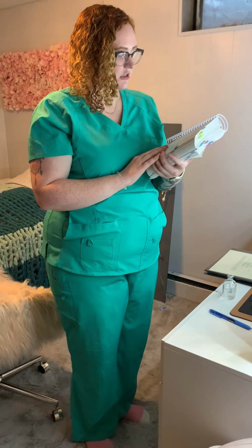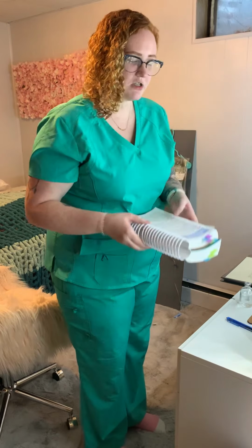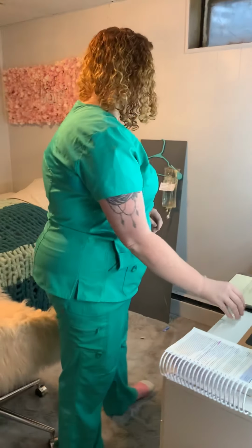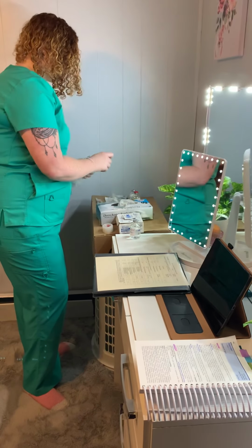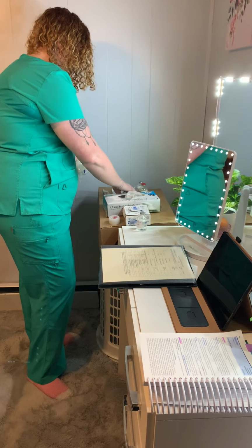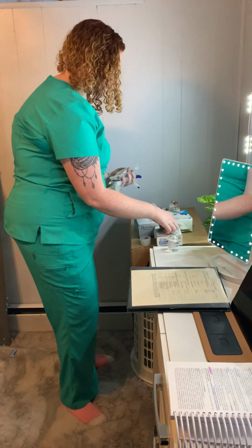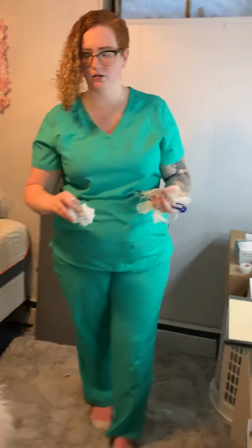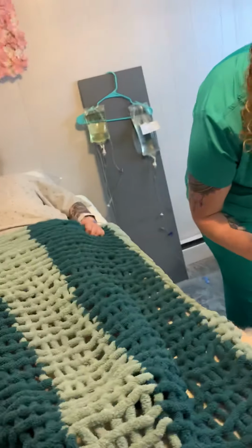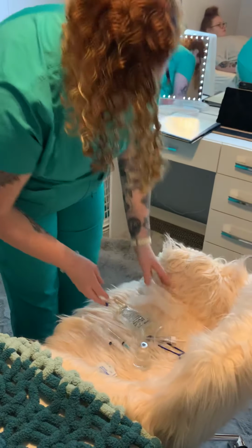For the rate of administration, each 20 milligram dose can be given over 15 to 30 minutes, and we will give over 30 minutes to ensure safety. I will gather my supplies. I will go into the patient's room. Perform hand hygiene and reintroduce myself to the patient.